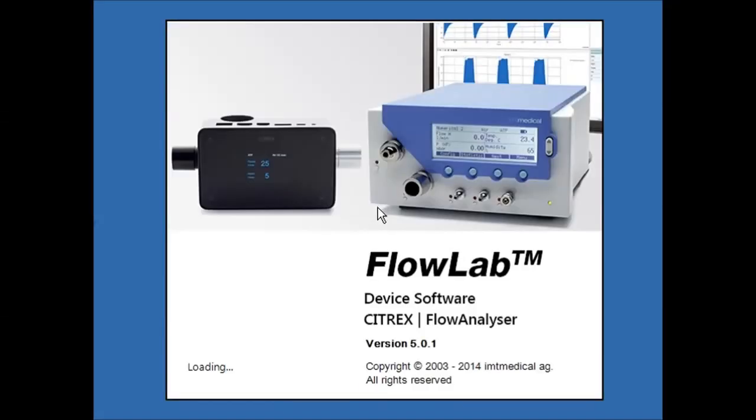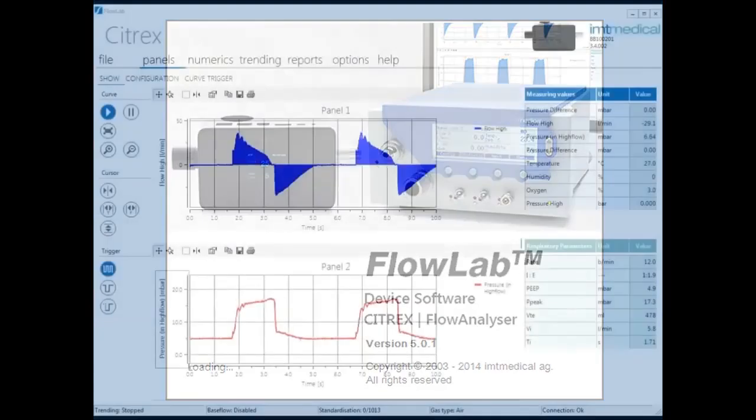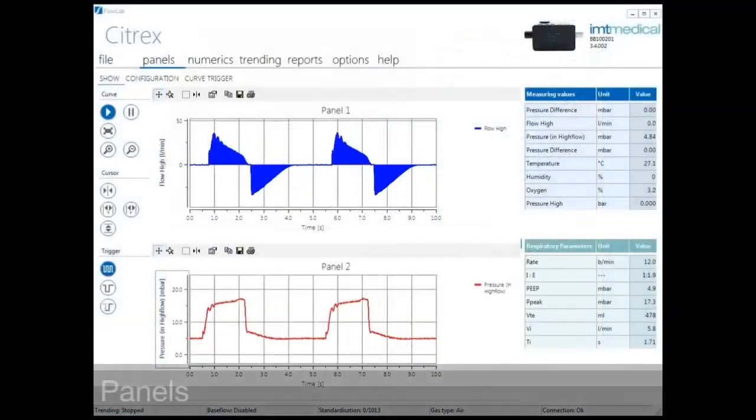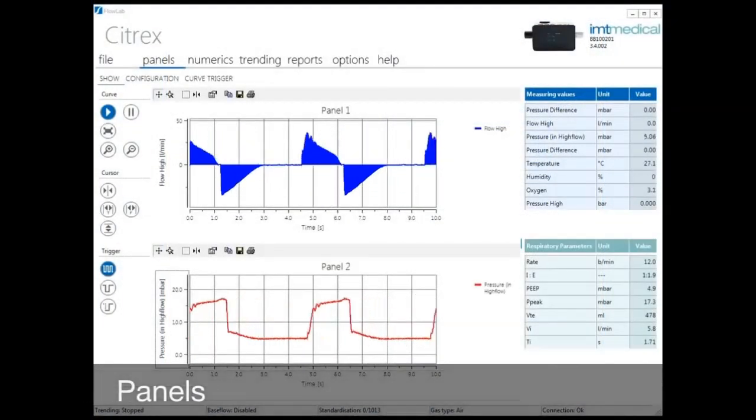Connect your PC or laptop via USB and launch FlowLab.